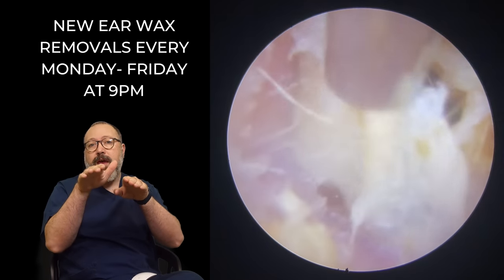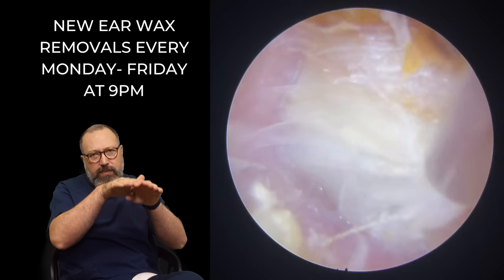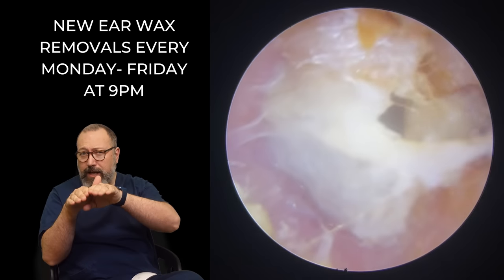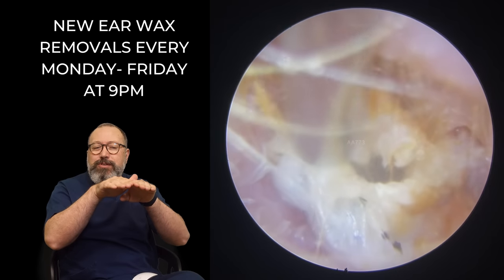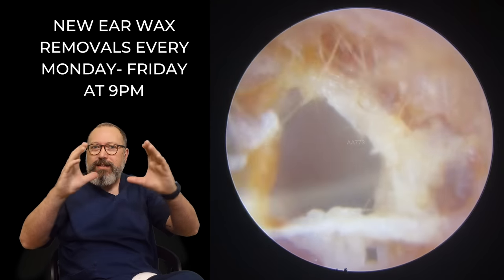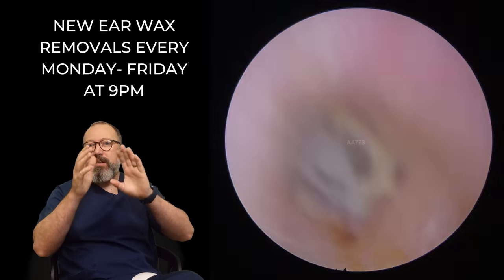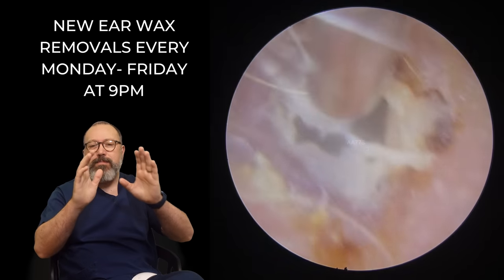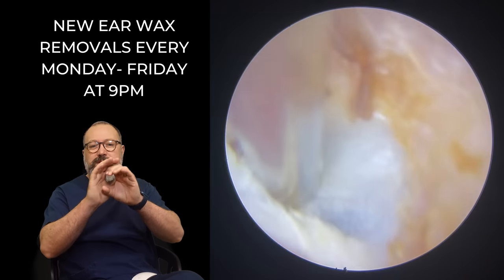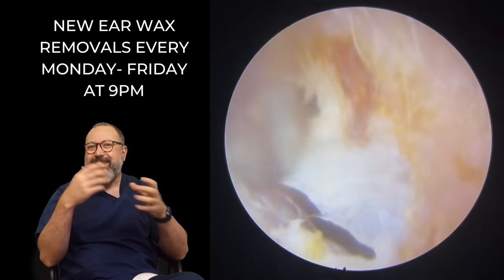What you get sometimes — and I see this a lot in more elderly patients — is as that skin migrates over from the bony portion to the cartilaginous portion, that surface layer will detach not just in one plane, but all the way around the canal. Unfortunately what we've got there is quite floppy skin, it hasn't hardened up yet, and as it closes in from all sides it can cause a few problems — it starts to harden up and discolour a little bit.